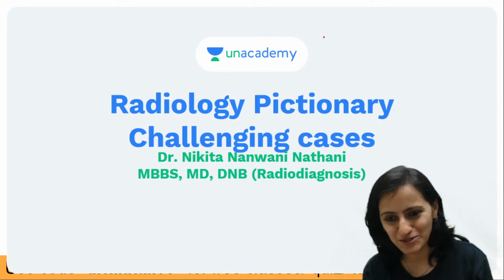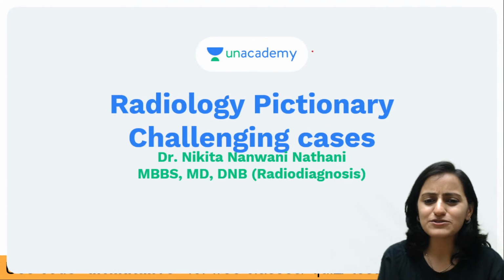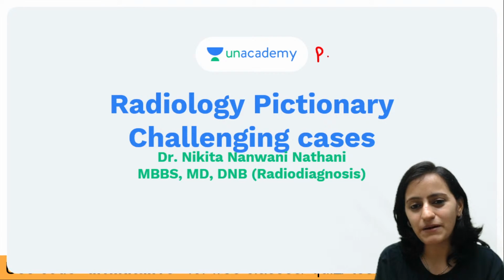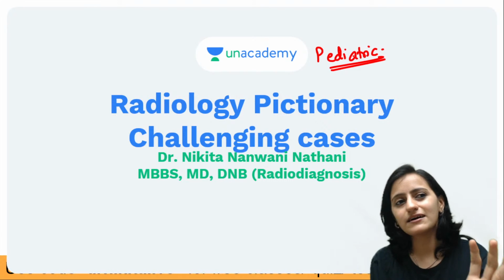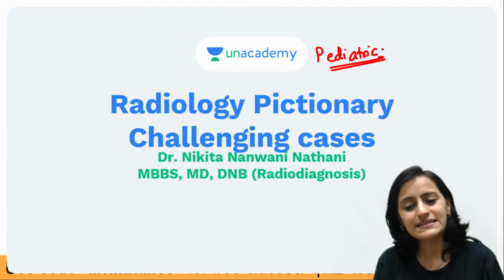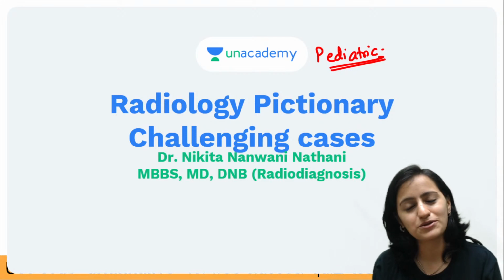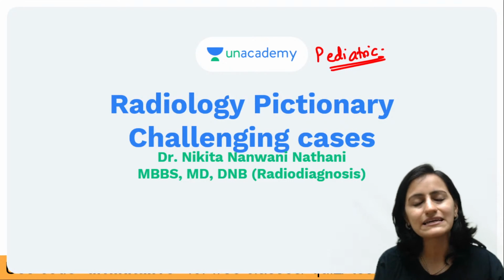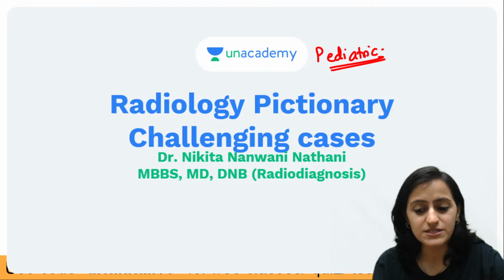You don't have the options here, because I want to see who gets this right. I have made your task easier by putting the challenging cases in pediatric radiology. Clinically and practically they are very important. It's just how they look on radiological images that we need to identify. So some very interesting, logical, conceptual cases are what we are going to see.